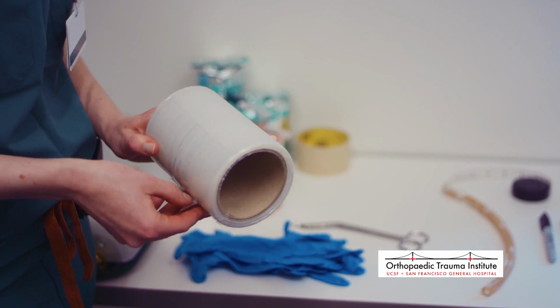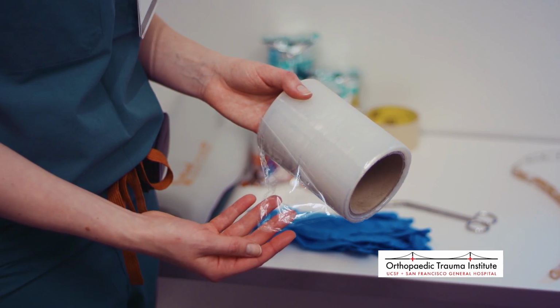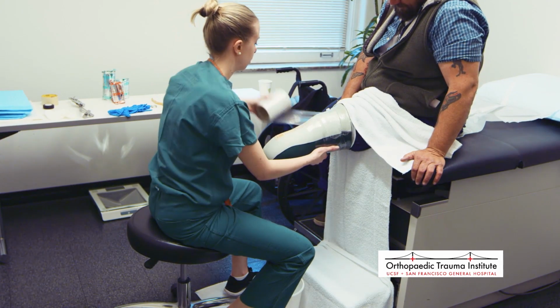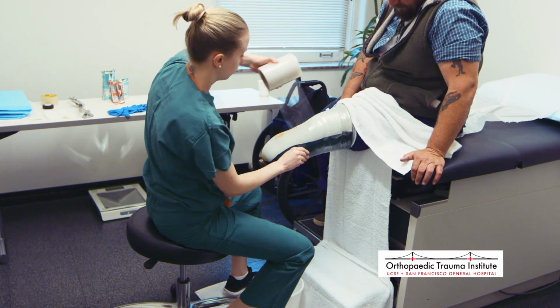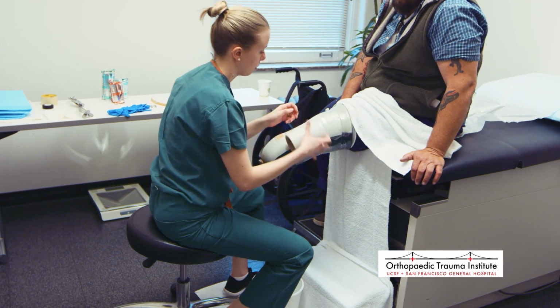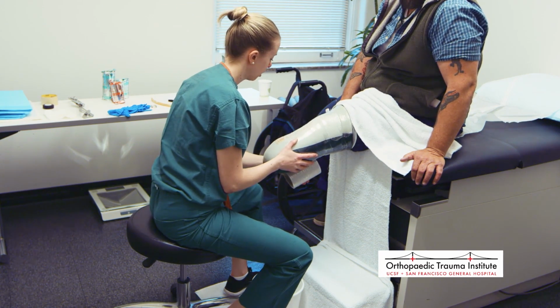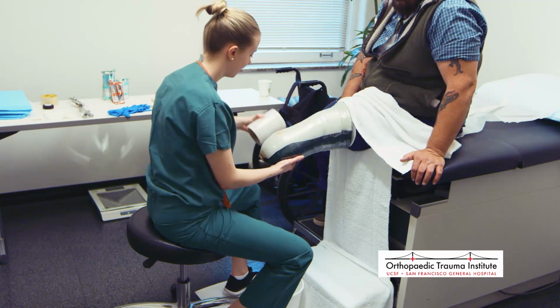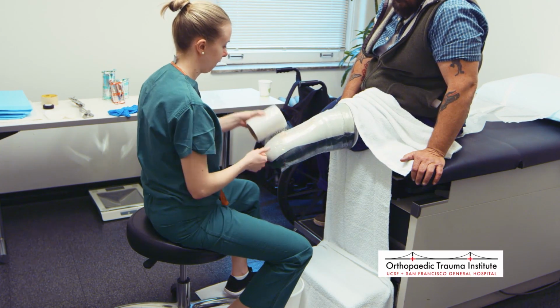Interestingly, we use saran wrap. When we're casting over the gel liner, we want to protect the fabric. So we wrap the saran wrap on top of the gel liner to protect it. And I also use the stretchiness of the saran wrap to help pre-shape the tissue on your residual limb. So it does two purposes, protects the gel liner and helps kind of tighten everything around the leg.